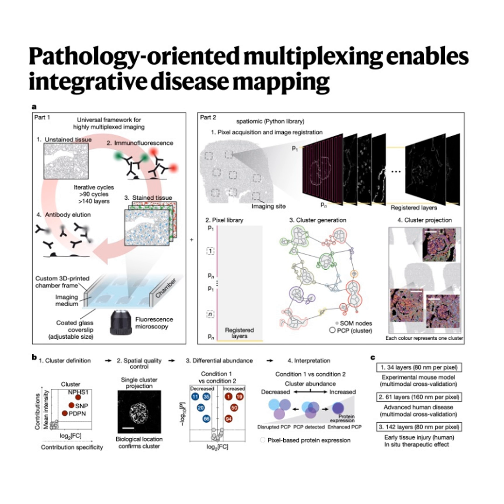PECs. Those are the cells that go haywire in CGN, right? They proliferate and form those destructive crescent shapes in the glomerulus. Exactly. And PathoPlex showed that the frequency of this PJUN-associated cluster 21 specifically increased within the PECs as the disease got worse in the mice. This strongly suggested that JUN activation in PECs was a key driver of crescent formation.